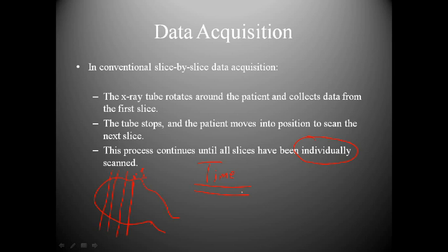I'll tell you an example of the growing dependency on helical scanning. One night through the ER, I was having to do a rib series, just conventional radiography on a patient. He'd fallen and was having trouble breathing, and then later had a headache.